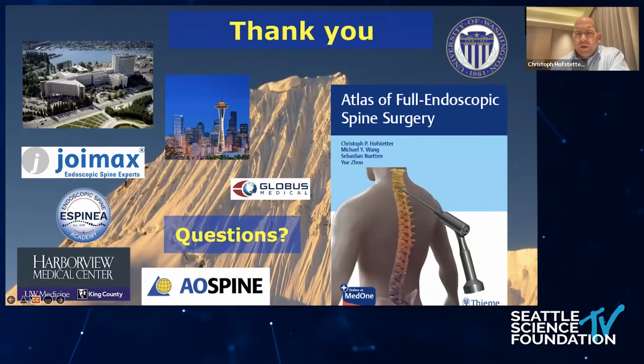Yeah. Hey, thank you so much, Osama, for the question. So regarding the bone SPECT, again, it has a very high sensitivity, but a very low specificity. In other words, there's a lot of things that light up. I think it's really helpful, typically after fusion surgeries, in cases where, for example, the dorsal column didn't fuse and the screw is just ever so slightly loose, and there's a minimal movement.